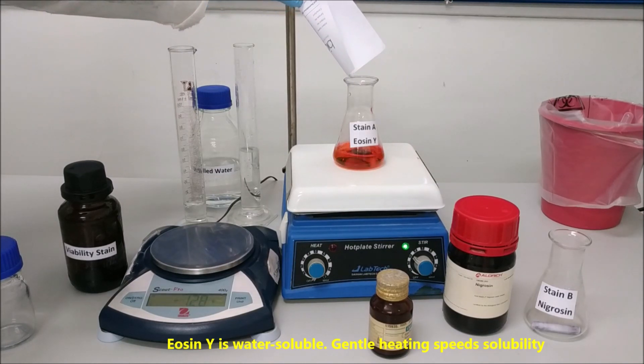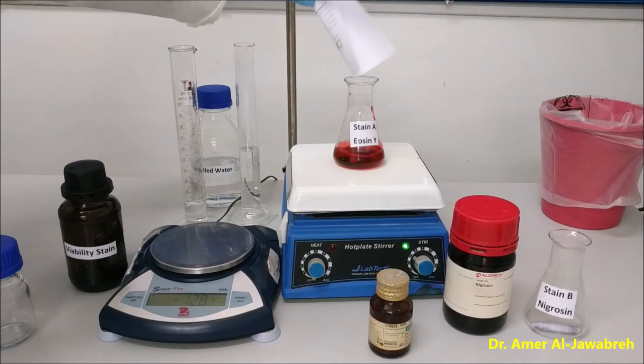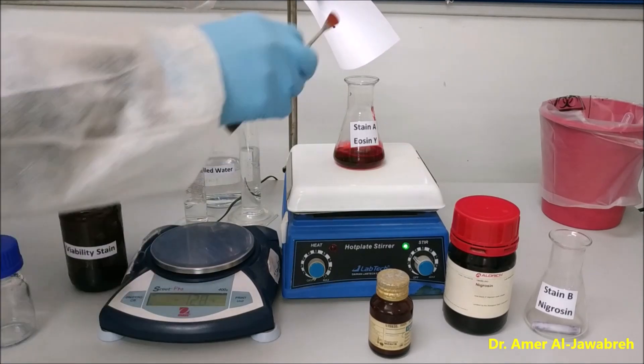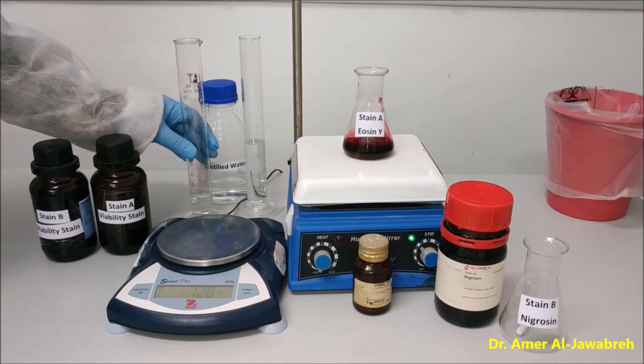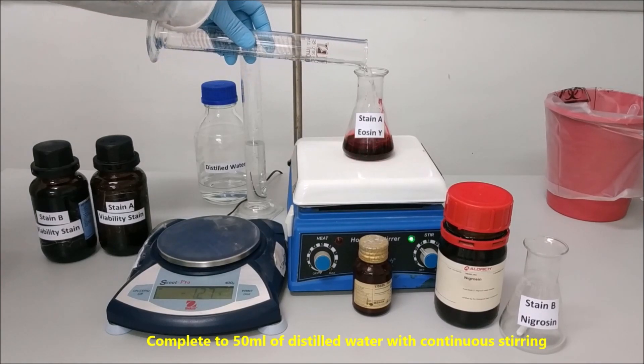Eosin Y is water-soluble. Gentle heating can speed solubility. Complete the volume to 50 ml of distilled water with continuous stirring.